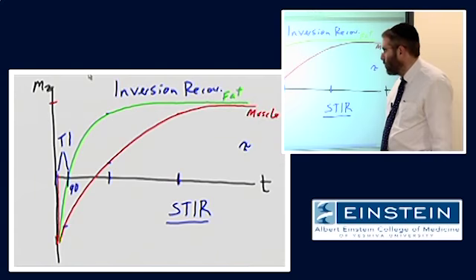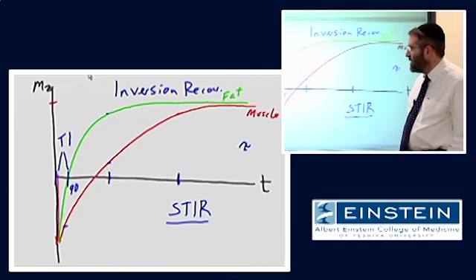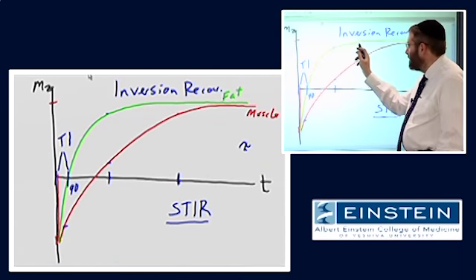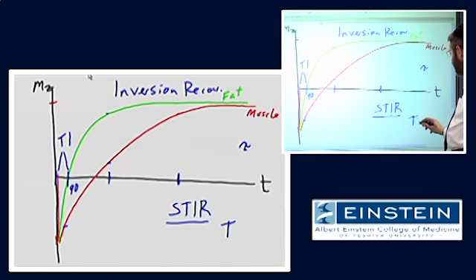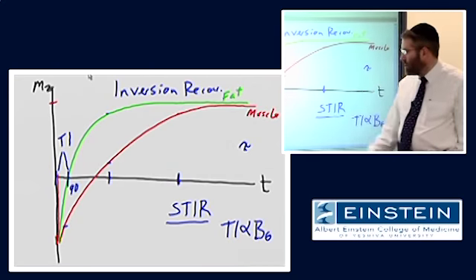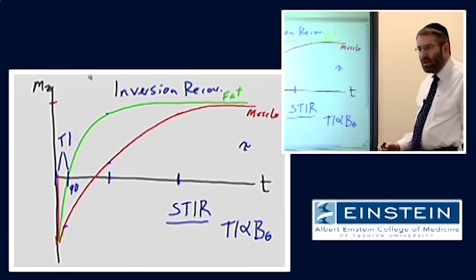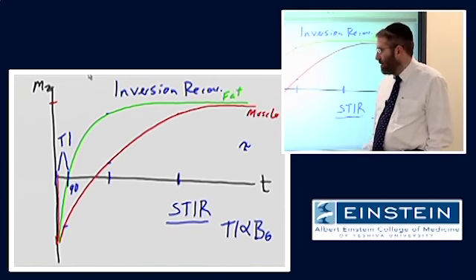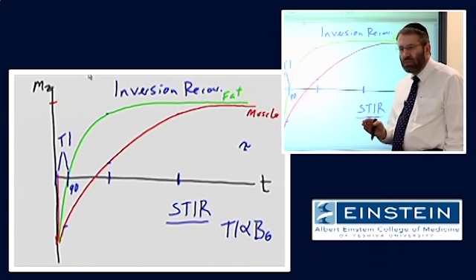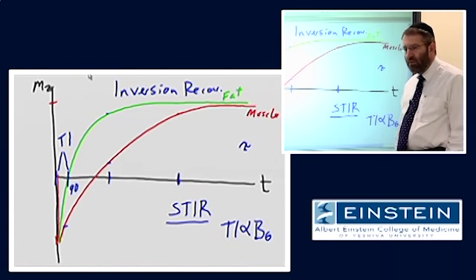Right? For this to work, of course, you have to choose exactly the right TI. And remember, for example, we said the other day that the T1 of a tissue, of all tissues, is partially determined by field strength. So this inversion delay that might work at 1 field strength, say at 1 Tesla, is not going to work at another field strength, 3 Tesla. And in fact, this is a number that really needs to be optimized on kind of a scanner by scanner basis, because there can be very slight variations in the static magnetic field.